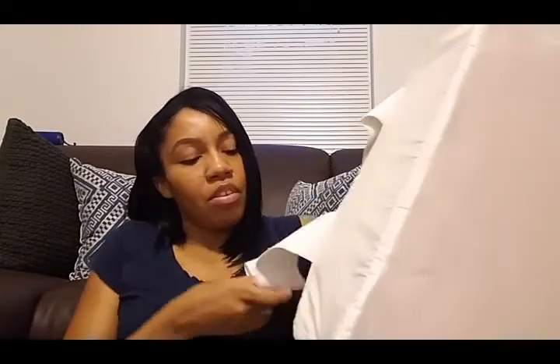I hope I could get this one in the shot. So this is something that I was actually using before my surgery, and I used it a little bit after my surgery. I'm going to have to show you guys as well how to use this. But it's basically a wedge that you place between your legs. And then it has Velcro straps on each side, so that you can actually strap your legs into it. So I'm going to show you guys more how to use this.